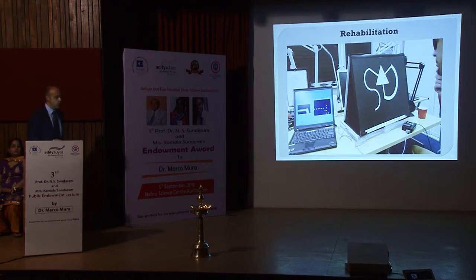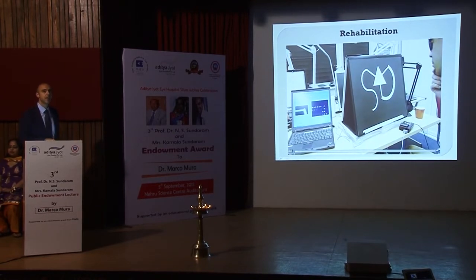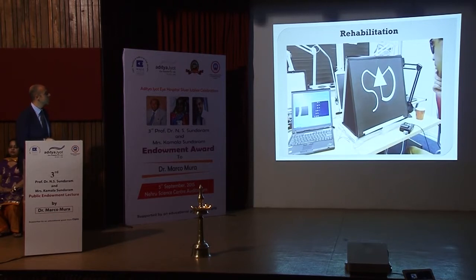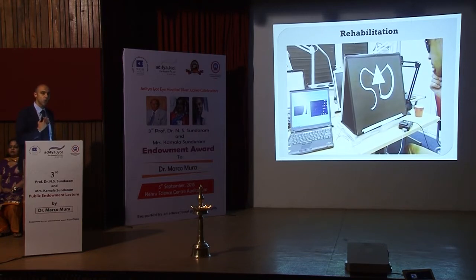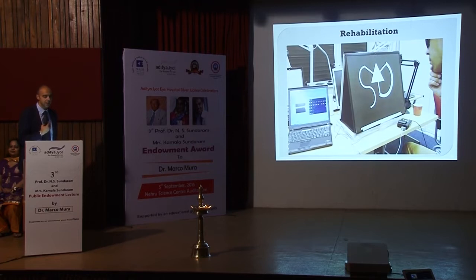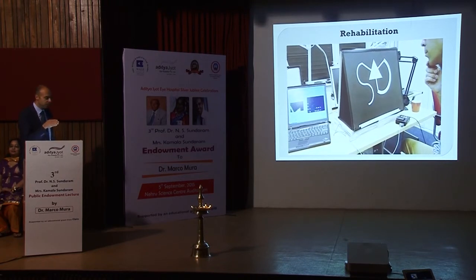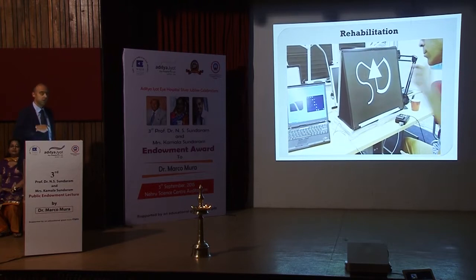This is just to tell you how important rehabilitation is. There are several sessions, usually starting 3 months after the operation. The patients have weekly appointments with the rehabilitation specialist, the low vision specialist, who trains them how to use the device. Because watching with a camera is not the same as watching with your own eyes. You have to learn how to move your head, to do scans, to be able to appreciate the difference in pattern of colors. And only doing this type of microscan allows the patient to have a perception of the artificial vision.